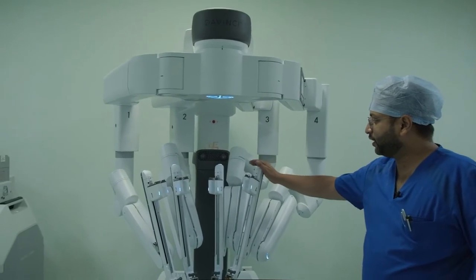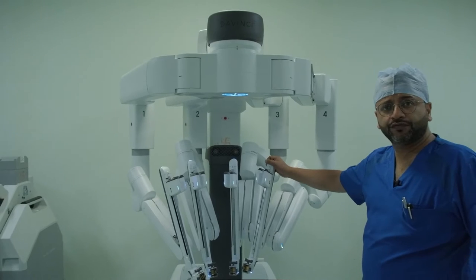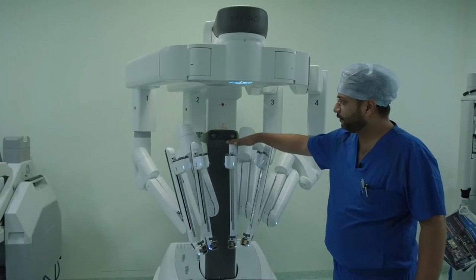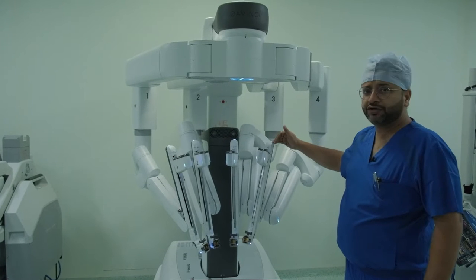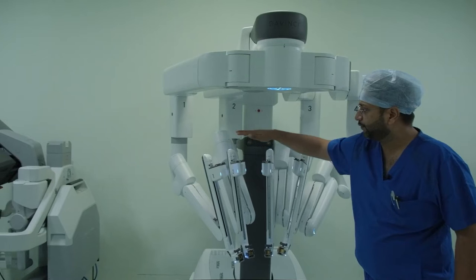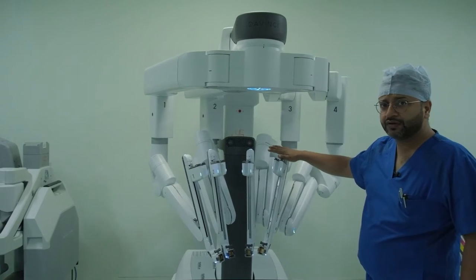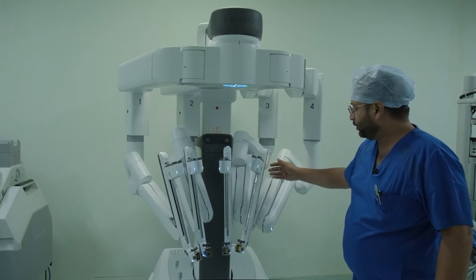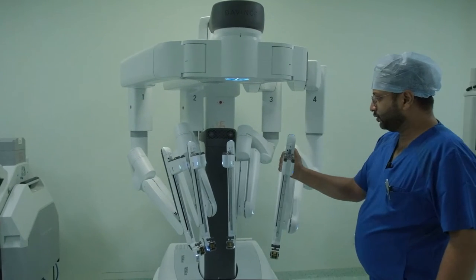So this is the patient cart, and these are the four universal arms. In the previous system, or the Si system, we had one camera arm and three instrument arms. In this system, the camera can go in any of these four arms. These are four universal arms, which all have 8mm instrument capability, and they can be moved like this.